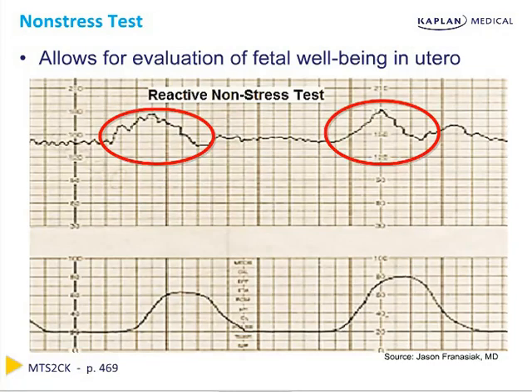If the non-stress test is not reassuring and we don't see these fetal heart rate accelerations seen here indicated by the red ovals, the fetus could be sleeping. Vibroacoustic stimulation can be done in order to wake the baby up.